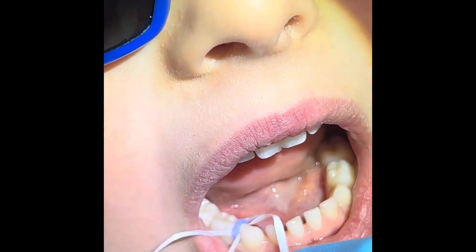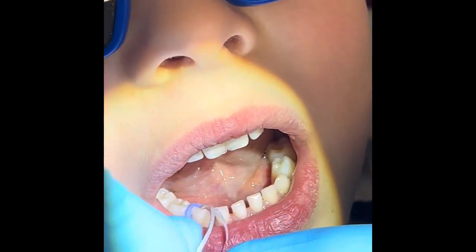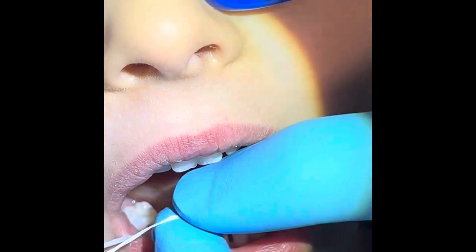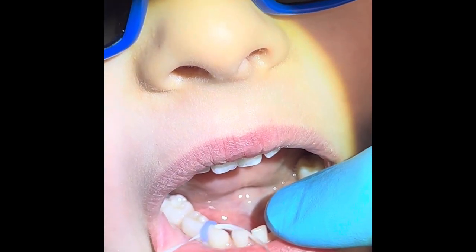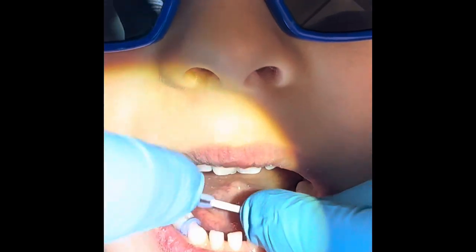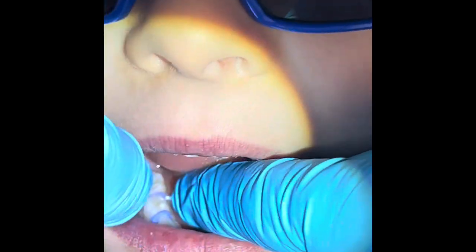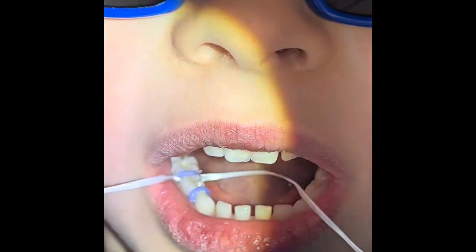And we take out the little whiskers — nice job — and then we're gonna floss one more, same exact thing. Open really big and we floss. Look at that, you're done!